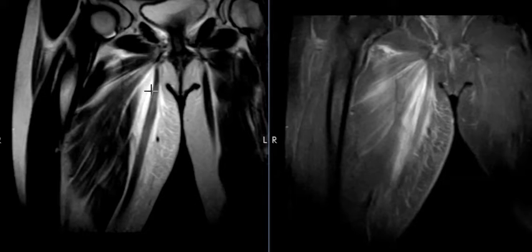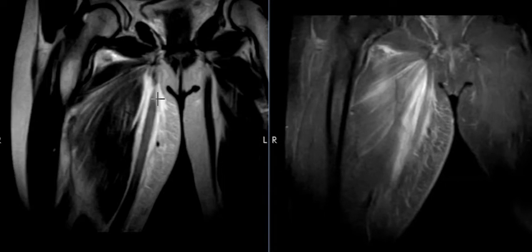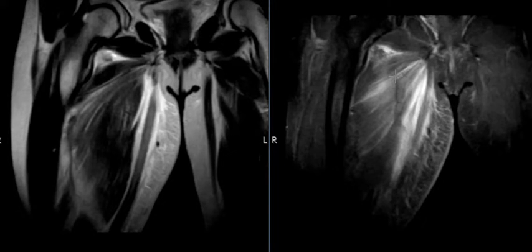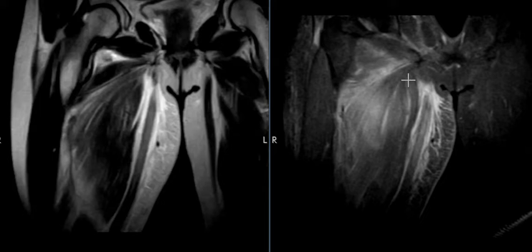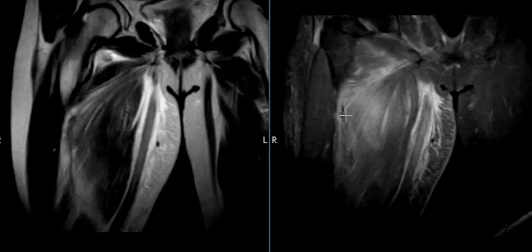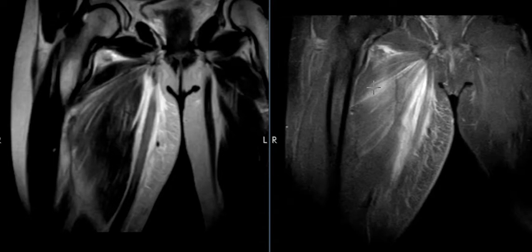And it's a little bit foggy on the axial images. We can see a longitudinal tear of that. And it has edema surrounding it. So the gracilis is partially torn, strained. You can see this foggy brush-like area of brightness within the adductor muscles. These are all the adductor muscles that come sideways here, off from the pelvic bones, out here to the femur. And the adductor muscles are partially torn or strained here.